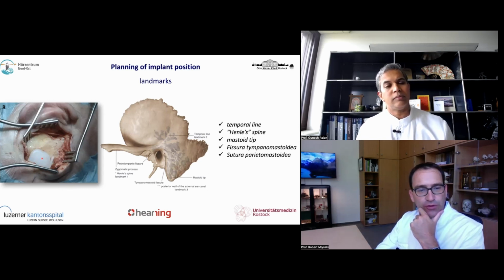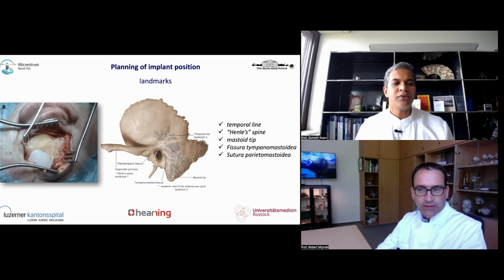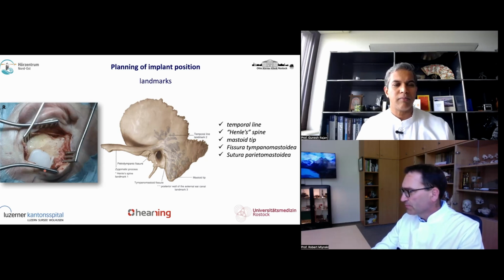If you continue preparing your periosteal pocket, you should be aware of the asterion, which can be opened. It's a drainage to the sigmoid sinus and transverse sinus, and can cause lots of bleeding. Bleeding can be stopped with a diamond burr without irrigation, or Knochenwachs. Bone wax, yeah. The emissary veins, there are so many variations of the emissary veins, but using the technique you said, with the burr without water, or using some bone wax, it really solves the issue.